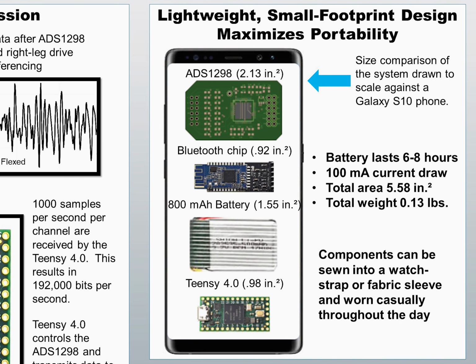On the left, you can see all the components of the system drawn to scale against a Galaxy S10 smartphone. The total area is about 5.5 square inches, and the weight is about 1/8 of a pound. Because usability and portability are important as well, some preliminary testing shows we can expect 6 to 8 hours of use before needing to change or recharge the batteries.